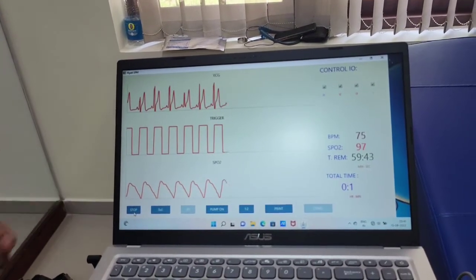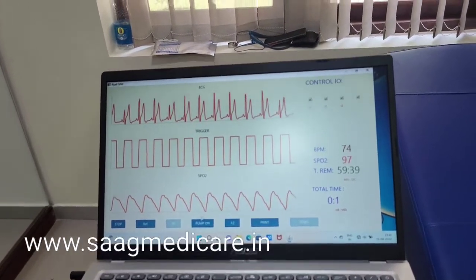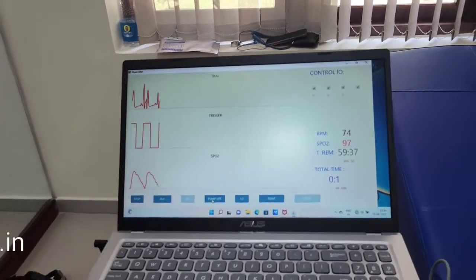Trigger and SpO2. Then after, just turn on the pump by pressing the pump on button.